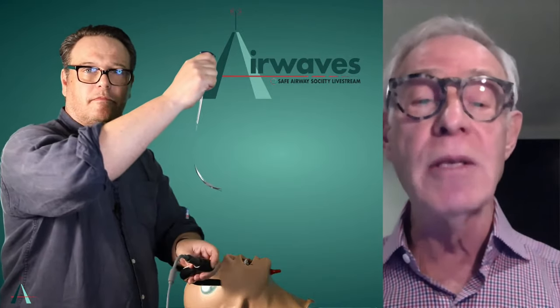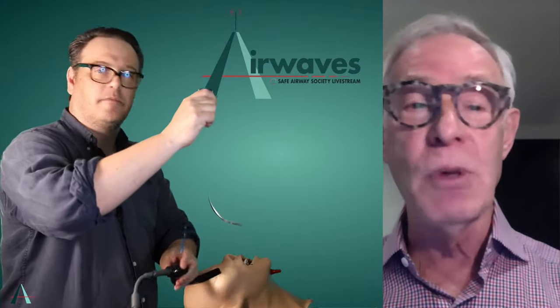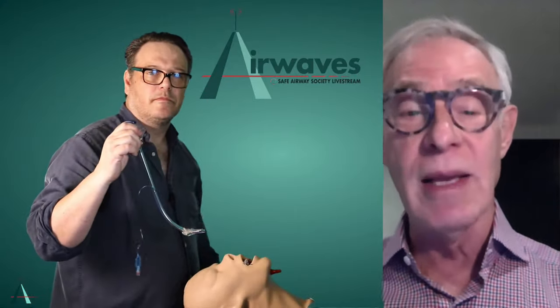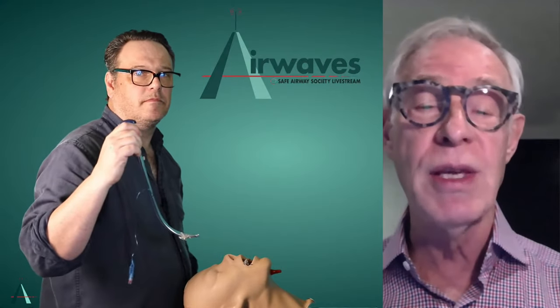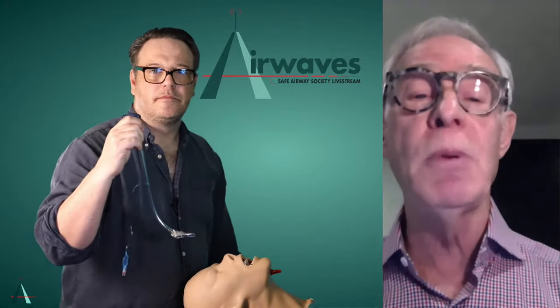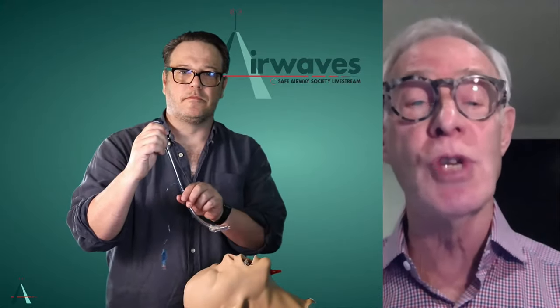So what I do, I describe it now as kind of like a droopy J. And I use a malleable stylet 90%, 95% of the time. I use the GlideRite or the stylet that comes with the GlideScope, primarily to teach people this is the shape that I'm trying to achieve. So you can use either.